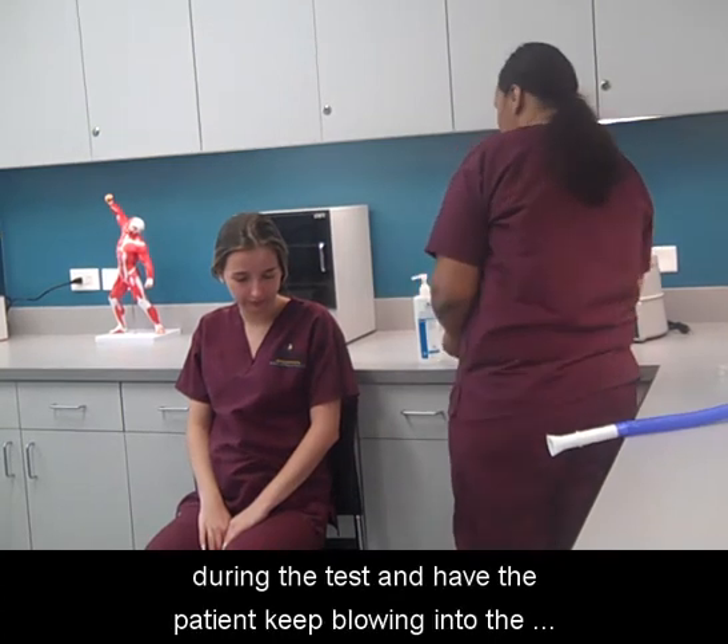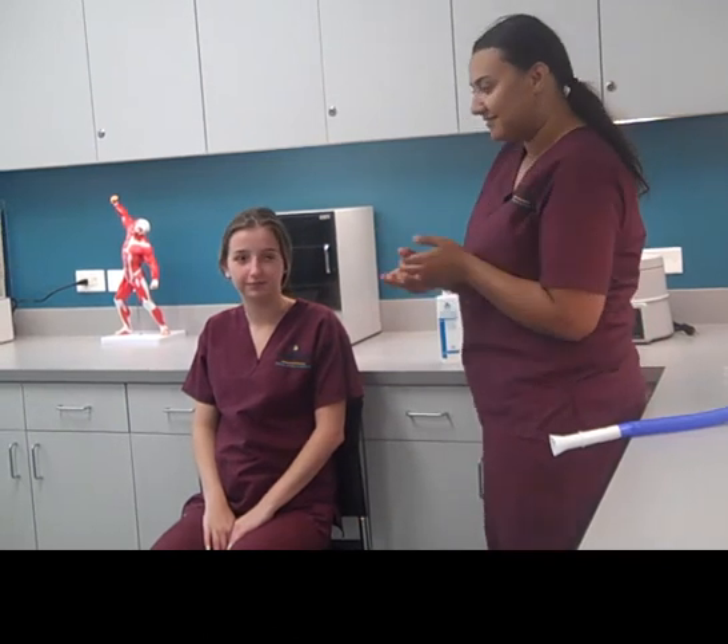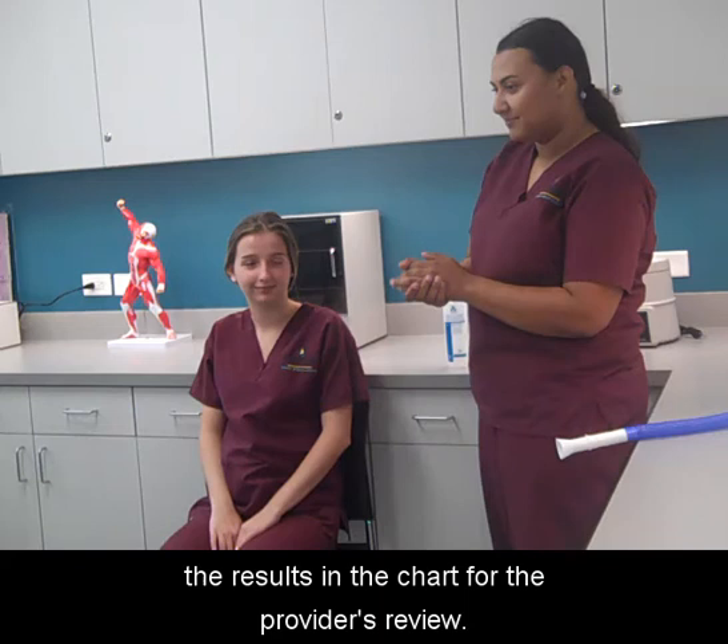Support the patient during the test and have the patient keep blowing into the mouthpiece until told to stop. Document the procedure in the patient's chart and place the results in the chart for the provider's review.